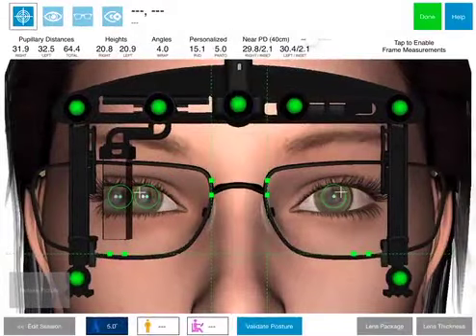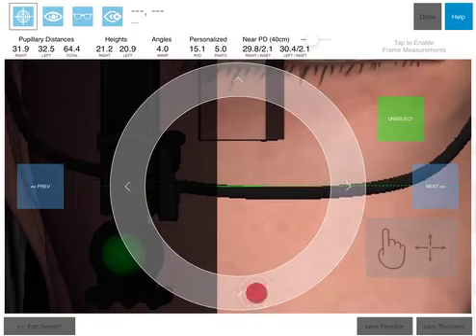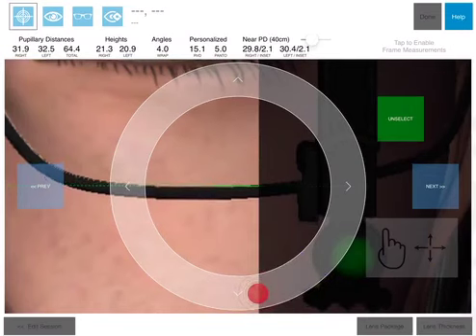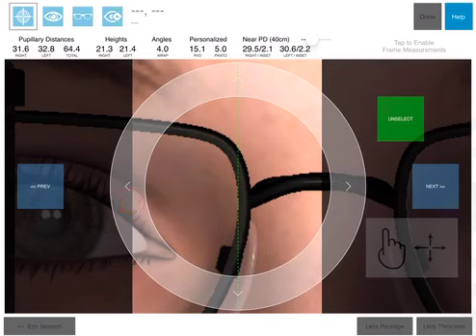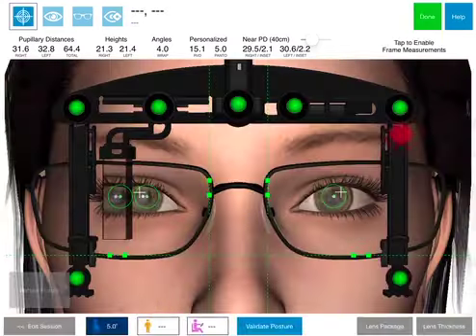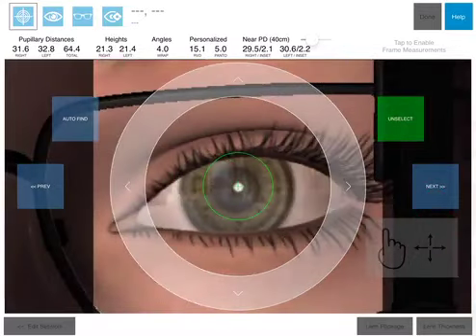Perform the following verifications. Verify that the horizontal line is placed on the inner edge of the frame where the frame and the lens come together. Verify that the vertical lines are placed on the inner edge of each lens on each side of the bridge. Verify that the pupil and prism marker locations are positioned on the corneal reflection.